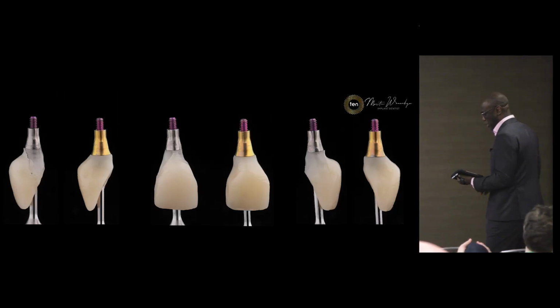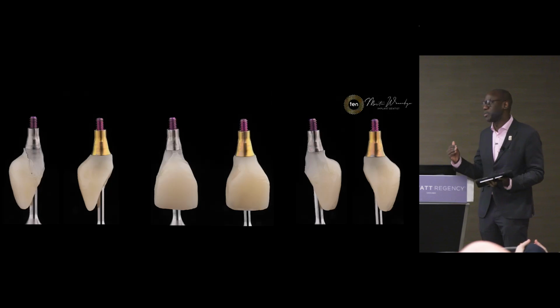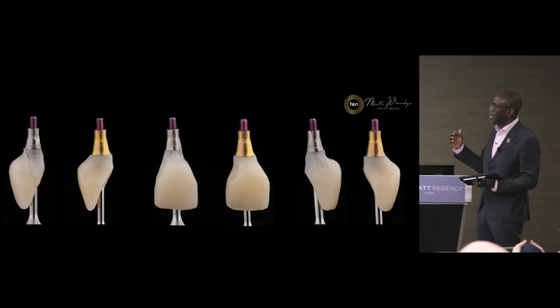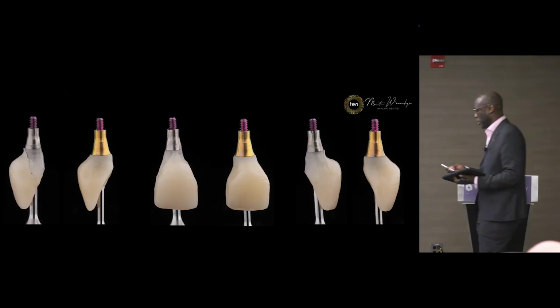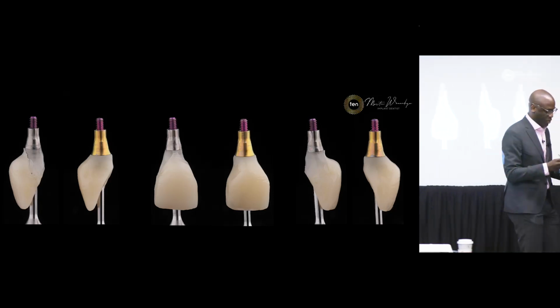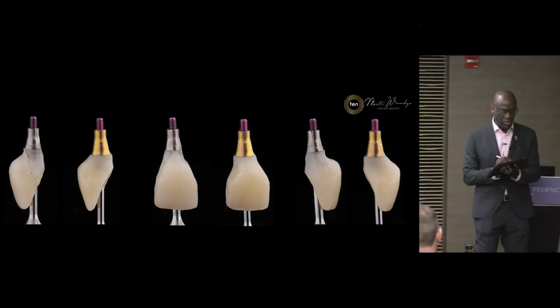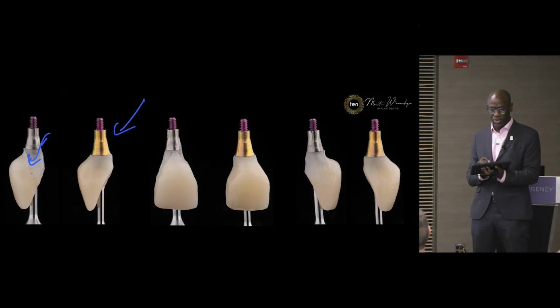The other thing we're going to talk about, and I'm going to hand over to Steve halfway through this, is when we're using these, how do we decide where to position this? So here you're seeing a provisional, and again, if you look very closely at this area, you'll see that we have a small crack in place. That crack has happened because, as I described before, we've had lateral load on there and we don't have enough to contain it.